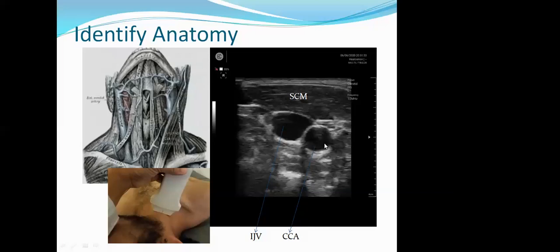If you look over here, the common carotid artery will show pulsation and has a little thicker wall, but the internal jugular vein will have a bigger diameter, and its pulsation will be more with respiration. So this is the short axis view. My probe is in the transverse direction, so this is the short axis view of the vessels.